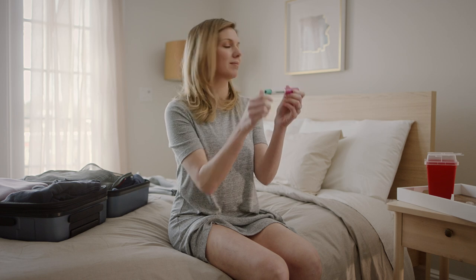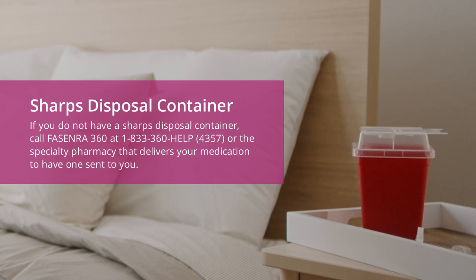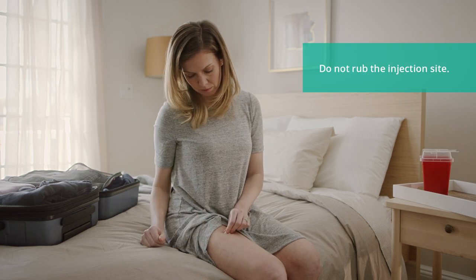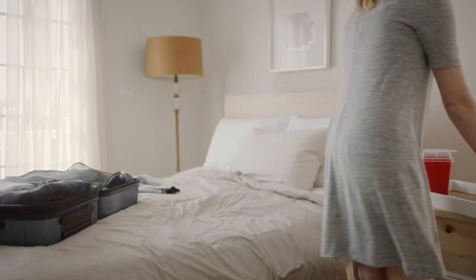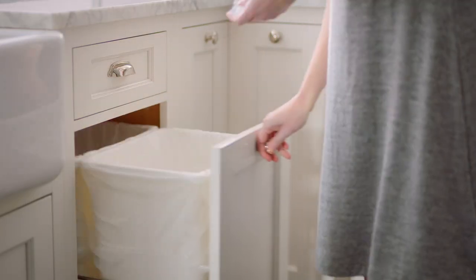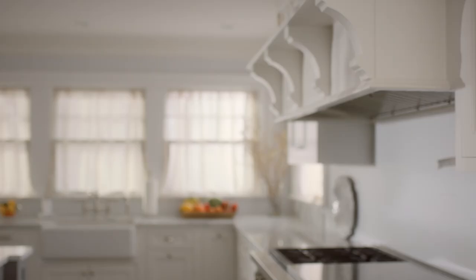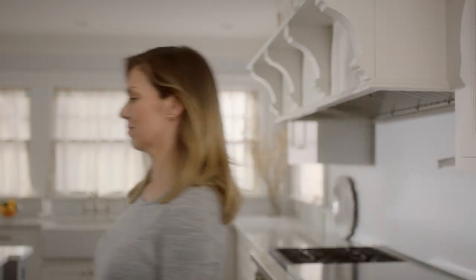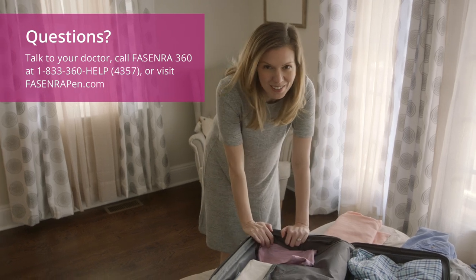To dispose of the used pen safely, put it in your sharps disposal container right after use. Do not throw the pen away in your household trash. You may see a small amount of blood at the injection site. Gently apply pressure to the area with the cotton ball or gauze until the bleeding stops and cover it with a bandage, if needed. Throw the cap and other used supplies away in your household trash. Follow your state or local guidelines, ask your health care provider, or call Fasenra 360 about the correct way to dispose of your used sharps disposal container. And that's that. Nice. Well, don't just stand there — we have more packing to do. Sounds good.